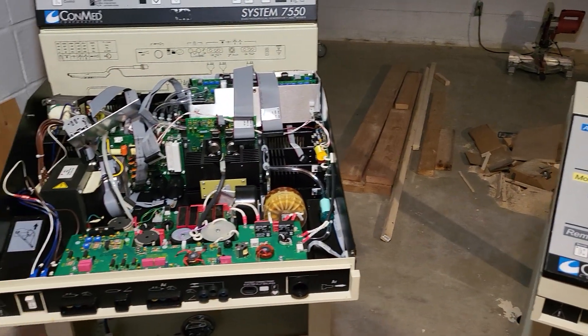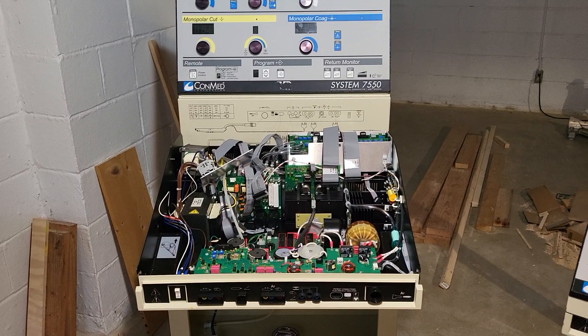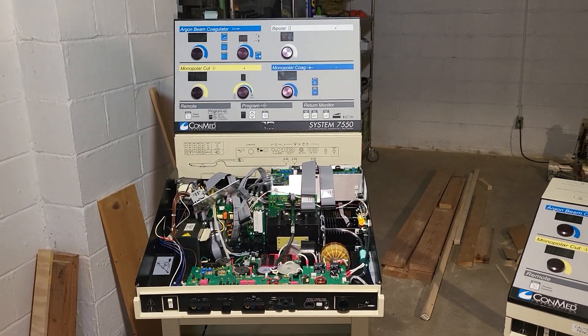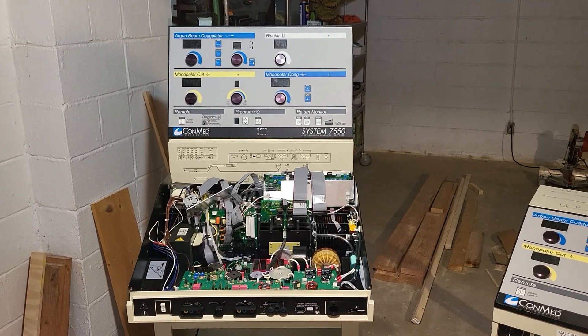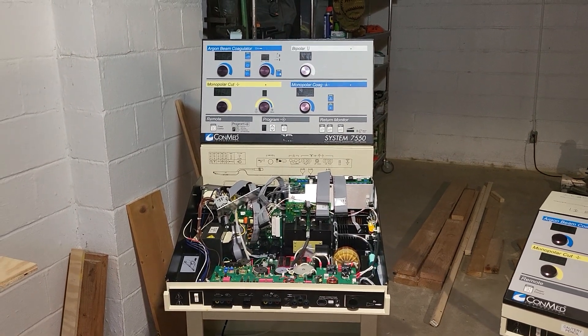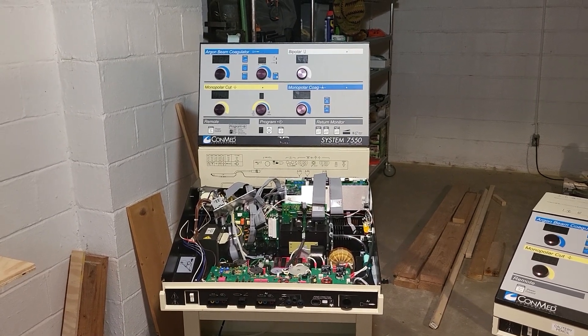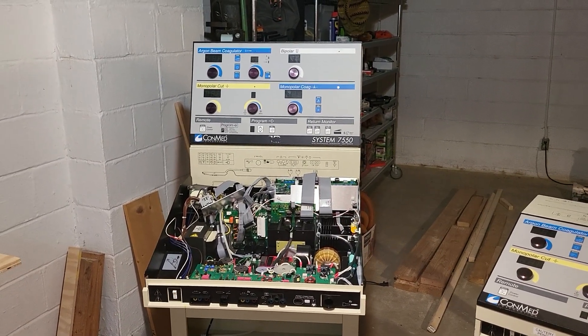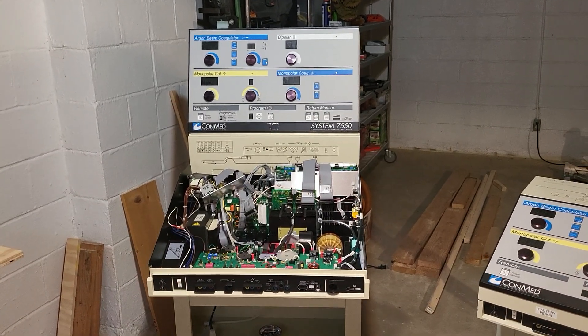We're trying to illustrate a concept in biomed training. So here's what we did — this was just a starting point. You can see that we've used the same cover but reoriented it, and removed the handle from the back so that we could get that control panel up at eye level, which opened up all the components.